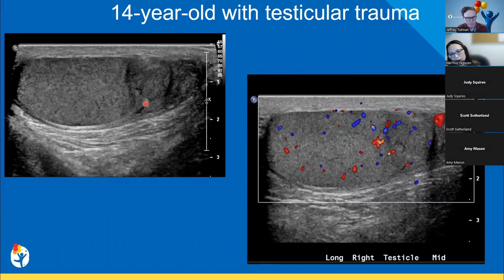No, I think I agree with that terminology. When I was training and reporting, it was more important to just describe whether the tunica is intact or not. And so I feel like in a way, that's the determining factor. I agree. I think your terminology is right.